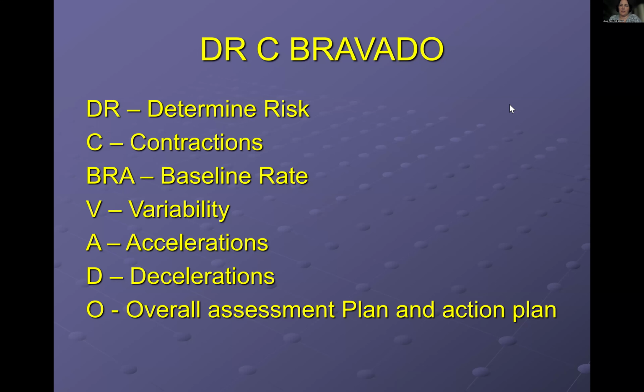Okay, so DR C BRAVADO. So let's just dissect it a little bit so we understand what each stands for. And then following that, I prepared about 14 different traces, 14 different cases, and we'll have the opportunity to discuss them together. As I said, there's no right or wrong, but we're going to discuss them and put ourselves in the shoes of the doctor on call, or the team on call, to decide together what type of action would be taken. But let's go through this, DR C BRAVADO first.